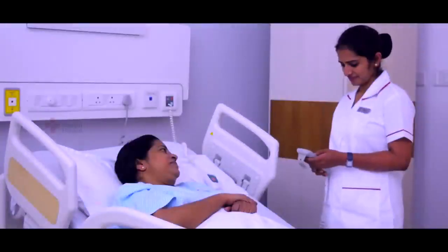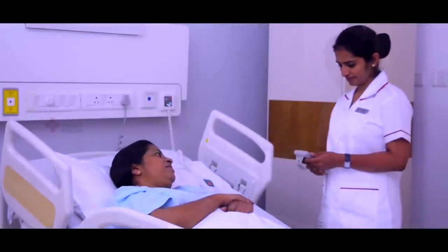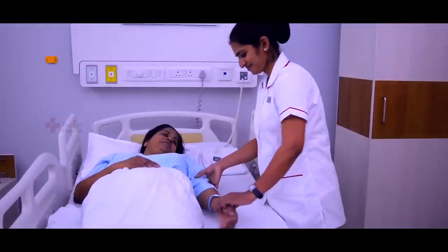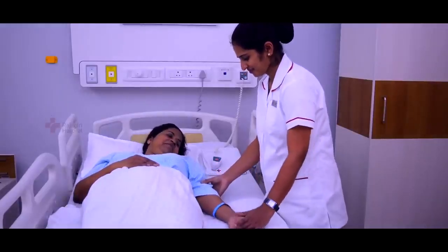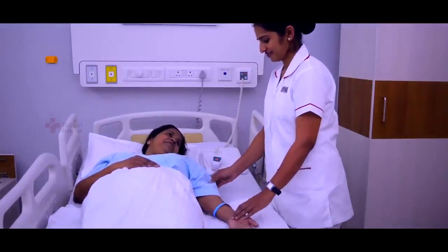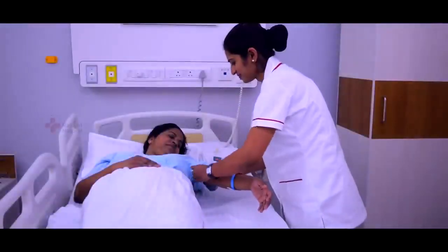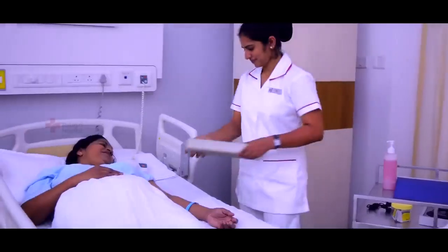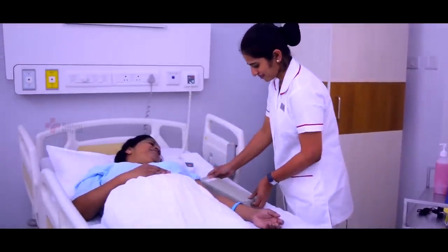For assessing the blood pressure, position the bed. The elbow should be slightly flexed with the palm of the hand facing up and the forearm supported at heart level. Expose the upper arm. Place the sphygmomanometer at the heart level.